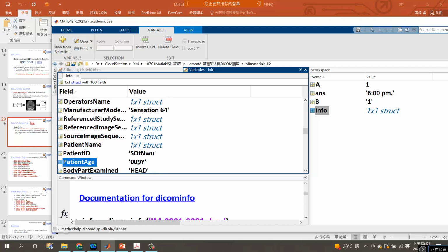But you may think it's really weird because it's a 0 age. It's simply because we try to hide some private information, so we did rename it. Originally, of course, the patient should have some age like 84, 85, I don't know. But we try to protect the privacy of the patient, so we just rewrite it, okay?